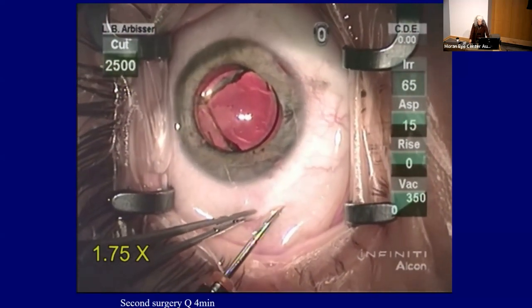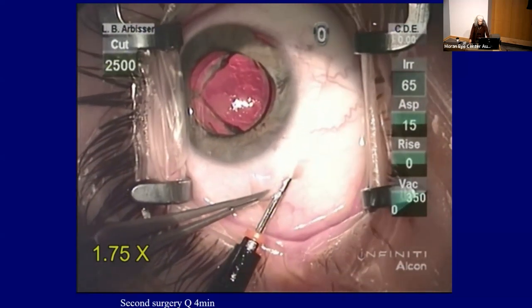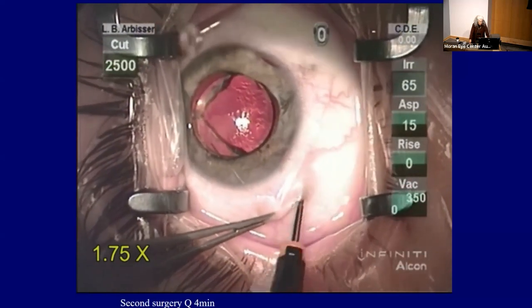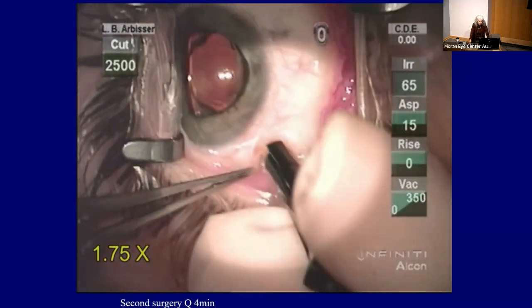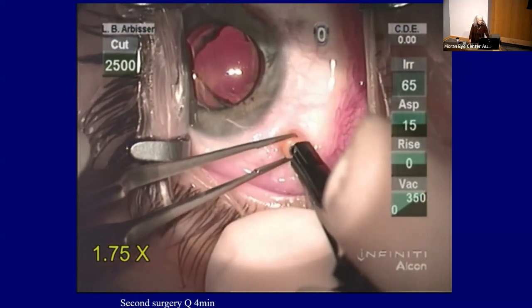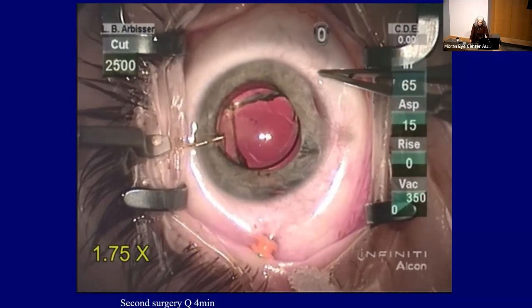We're going to use a trocar system to do the vitrectomy, because my plan was to do a one-port pars plana vitrectomy and a posterior capsulorhexis, to enlarge the YAG opening with a vitrectorhexis into something that was capturable for the optic.